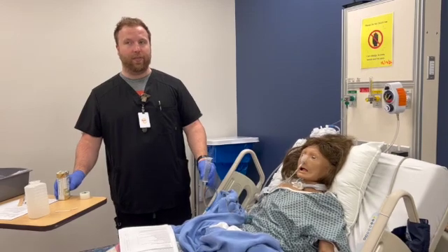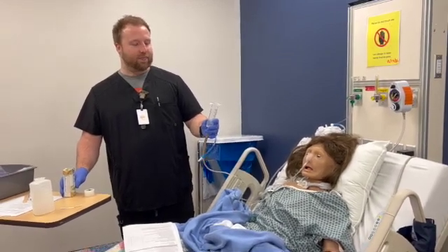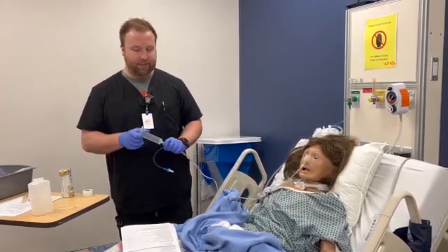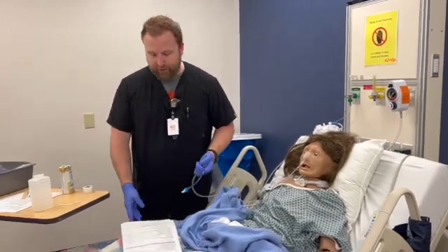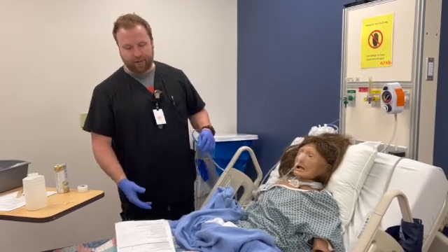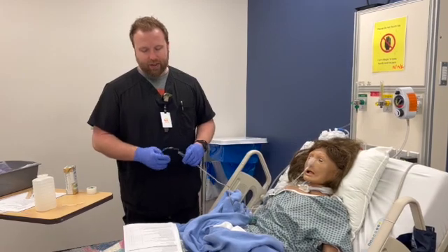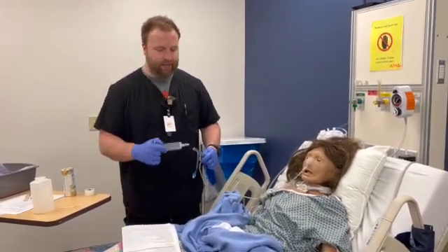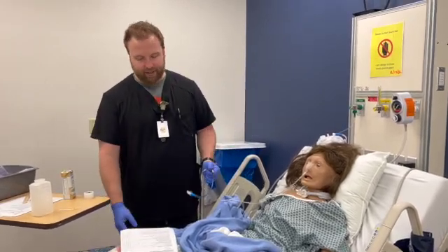As I go lower, it goes slower, and then we will assess our patient and make sure that the patient's not in any distress or any pain. After all that's done, we will flush with water again, having the patient sit upright for at least 30 to 60 minutes. Once you clamp tubing between flushes, if you're disconnecting this a lot, off and on, then you can clamp the tubing in your hand here.